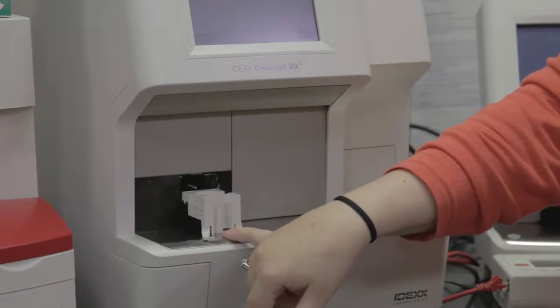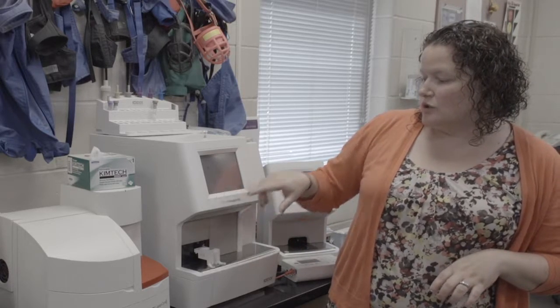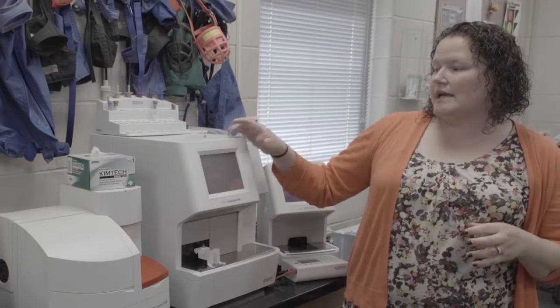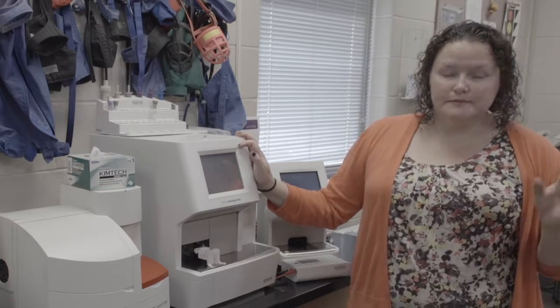Your slides go in the front. You want to make sure that your electrolytes are on the bottom, your chemistry is on top, and then any individual slide on top of that. Okay? So I'm going to delete this run so it closes. Once you hit run, it would suck it back in, take in the slides, take in the sample, and run. It is an 8-minute max run time if it's serum or plasma that you spun down yourself and put in a sample cup. 10-minute max run time if it's a whole blood separator. It's just the added 2 minutes to spin it.